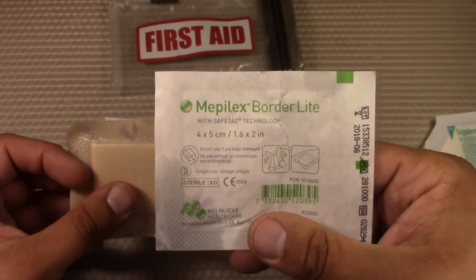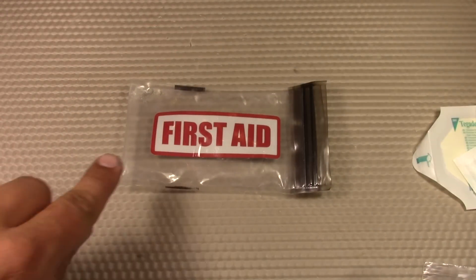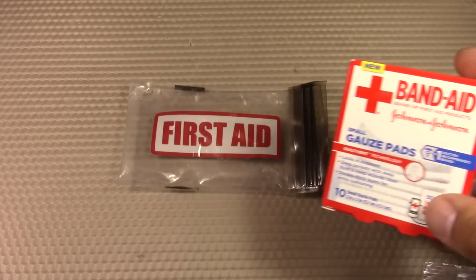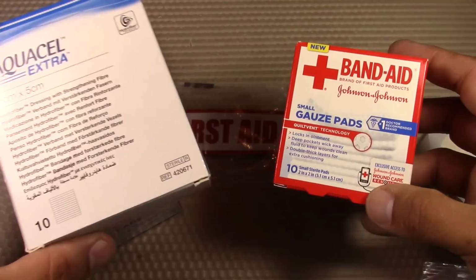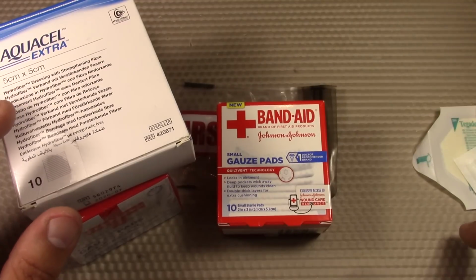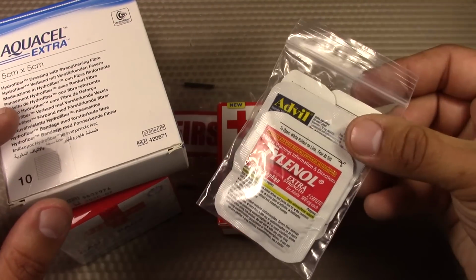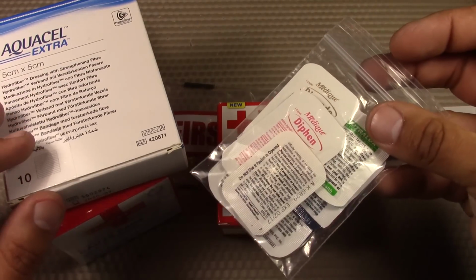So Mepilex bordered light dressing and the regular dressing. Those were all the items that were included in this particular version of the Mini Medi, although every Mini Medi that I make seems to be a little bit different. Sometimes I also include some gauze pads in there. Also, I might include some Aquacel, either the Extra or the AG. Also, every once in a while I'll include more of a pharmacy type kit, with some pills and stuff like that. But for this particular one, I just had bandages in there.